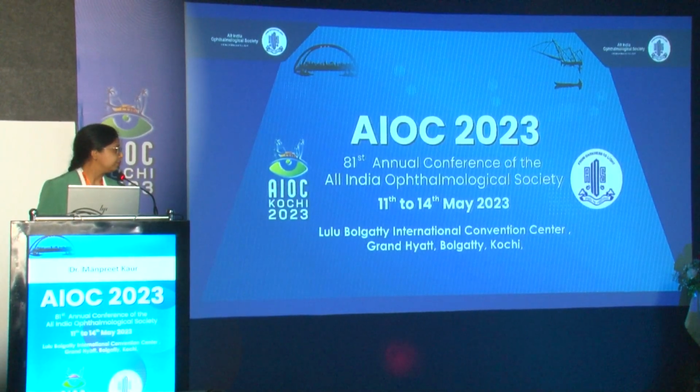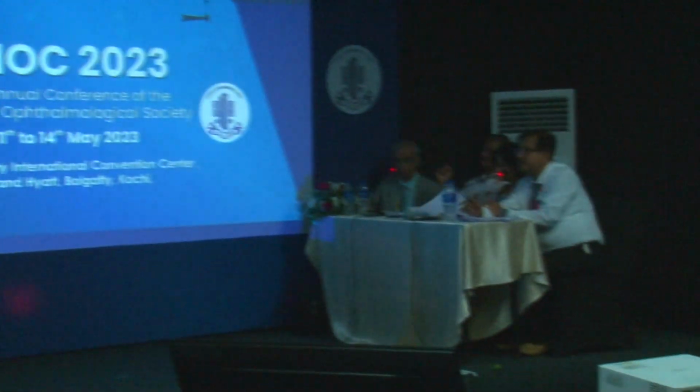Thank you, Dr. Manpreet. I think that was a very good and useful, timely study. Could you just tell us, is there any reversal of PC optic adhesion you find, maybe in the 1 year study, and then it goes back some? Was there any case? In one case. In one case in which the IOL was not completely covered with the rhexis margin. So eventually the cells, we assume, proliferated through that, and there was a mild decentration relative to every other IOL which was perfectly well centered, and the PC optic distance increased, and it developed a PCO as well.